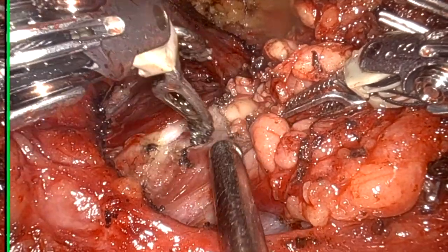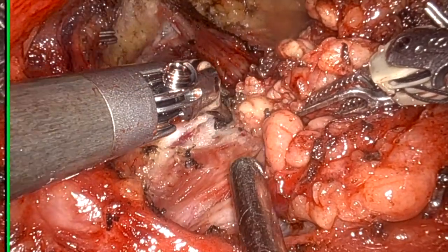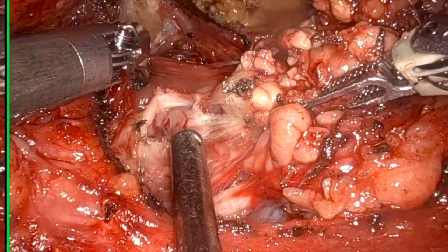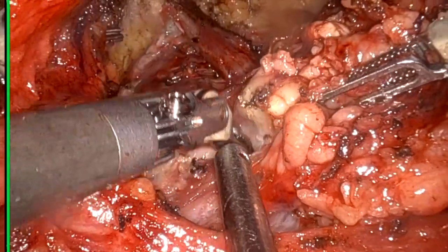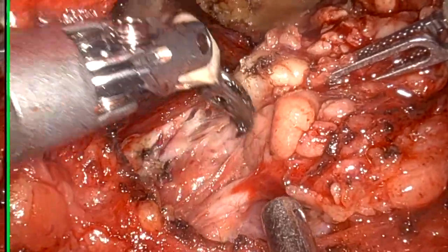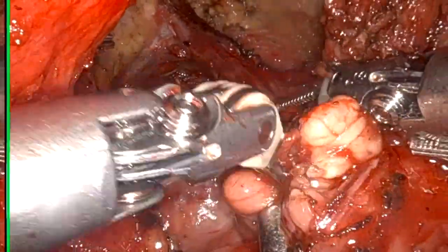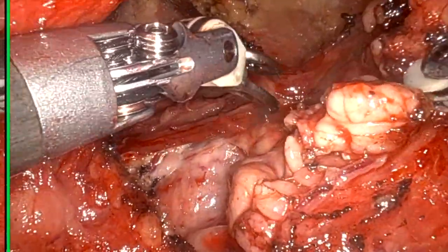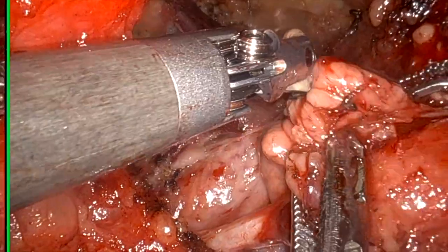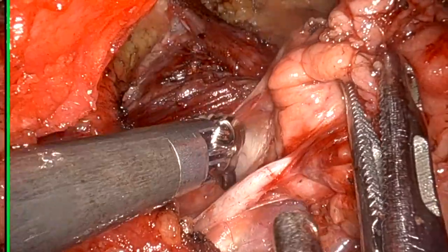Can you see the duct? This is the duct. What we call is Wharton's duct. For the parotid, it is Stenson's duct. For the submandibular gland, it is Wharton's duct. And here it is the hypoglossal nerve. So we got them all. So this is the hypoglossal nerve.